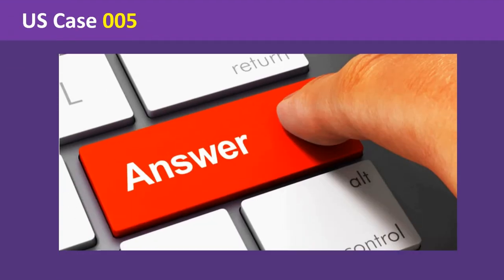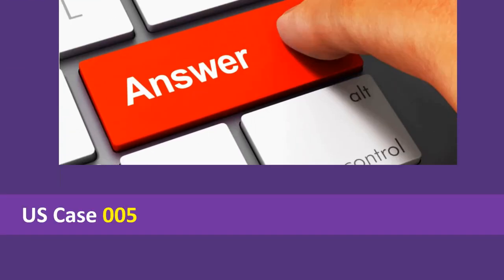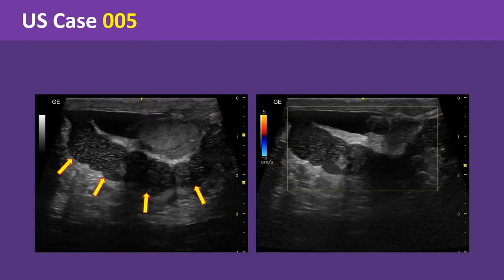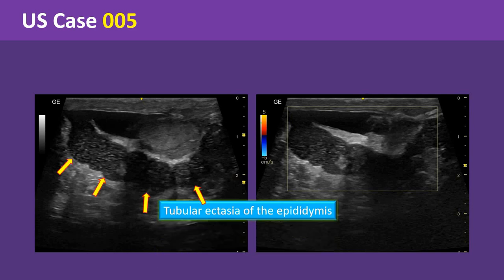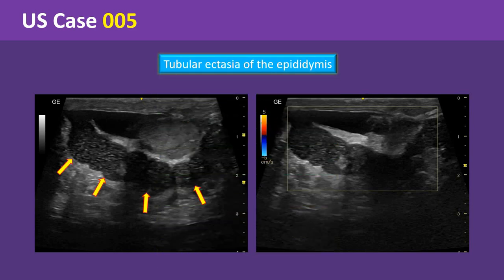Okay, let's see the answer. As you can see in these two images, the epididymis is diffusely enlarged. It reflects a hypoechoic echo pattern with speckled appearance. On color Doppler examination, there is no increased vascularity. These ultrasound features are highly suggestive of tubular ectasia of the epididymis.